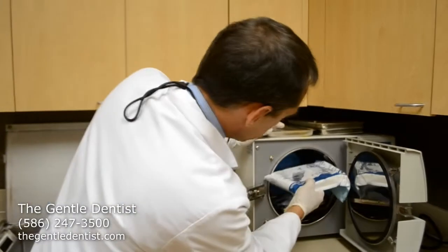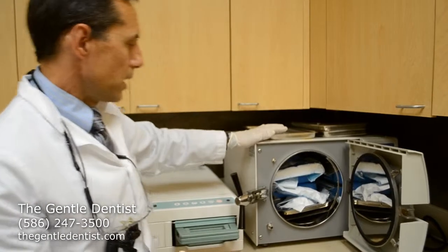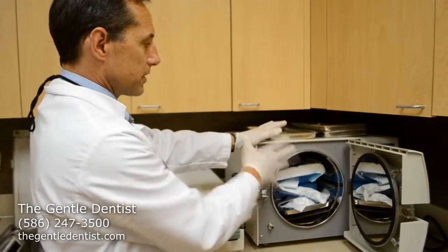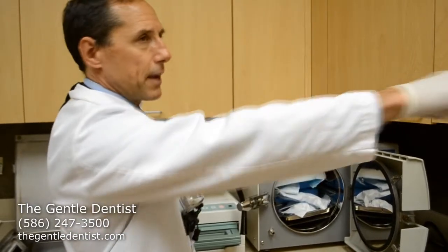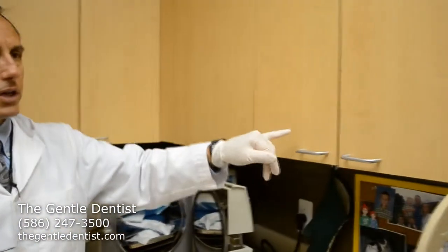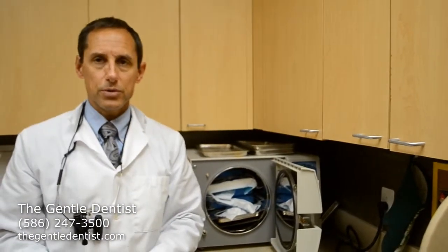And when they are sterilized, they stay sterile until the moment that we open them up. Okay? Once they are done being sterilized and dried, then we store them in our cabinet here. And from our cabinet here, then we wait until we do the procedure. Then we take them from here to the room where they'll be used.